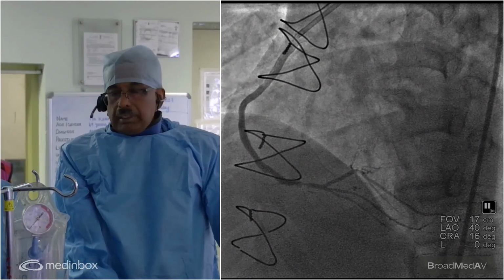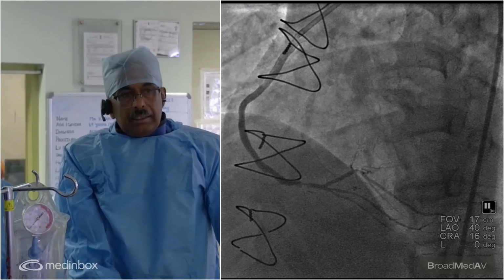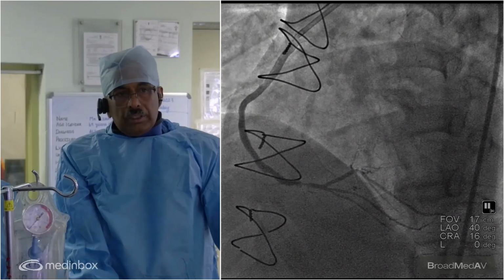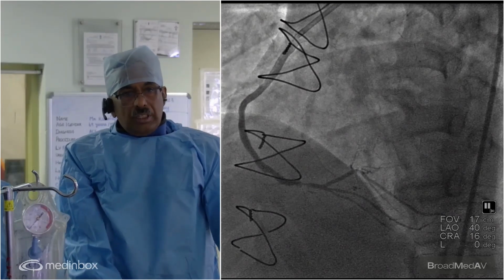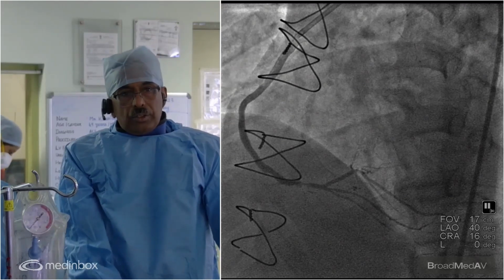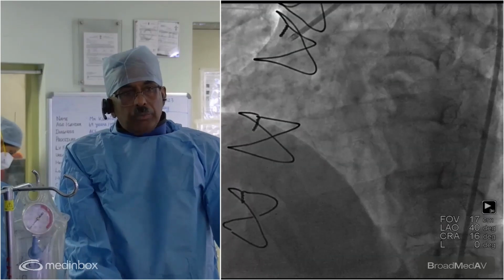One, antiplatelet therapy has got better. Two, we've got better low-profile stents, which don't cause much distal embolization. And three, the whole technology of stenting has changed completely under the guidance of imaging. So in this patient, the question is, will you protect or not?